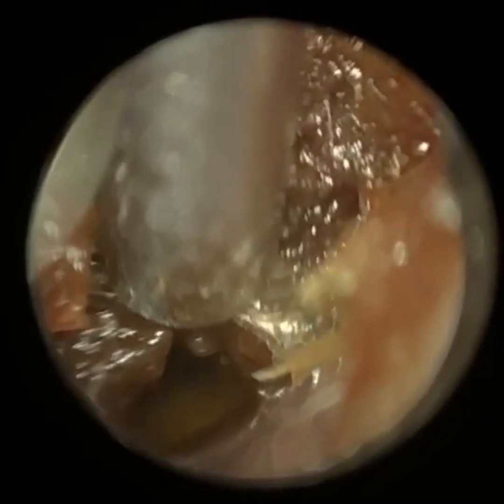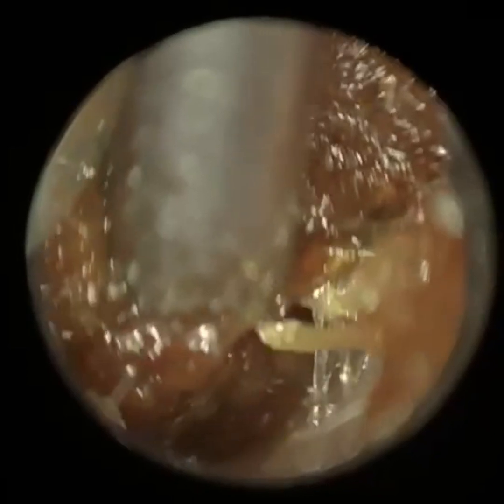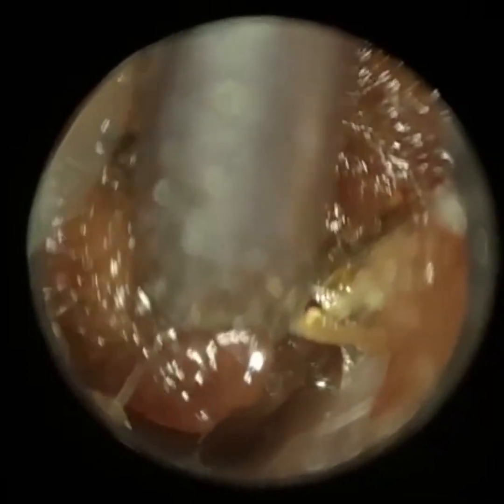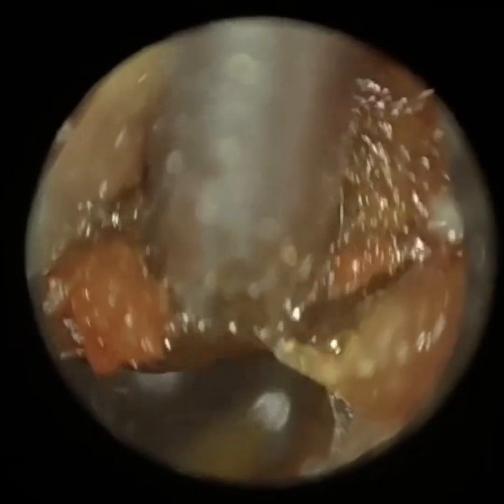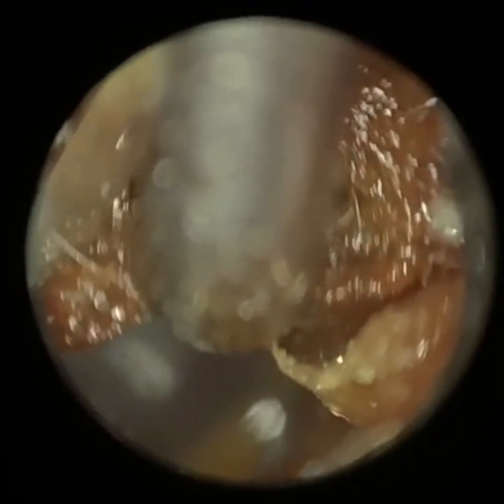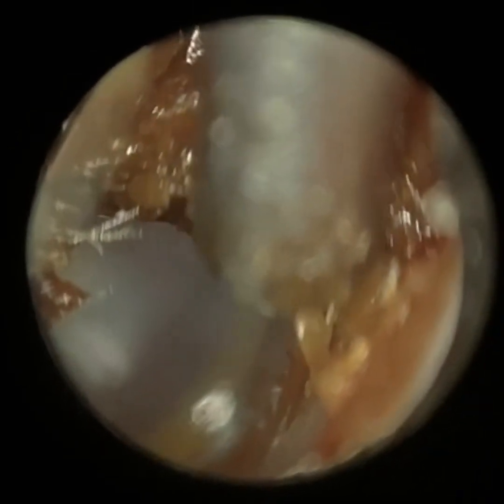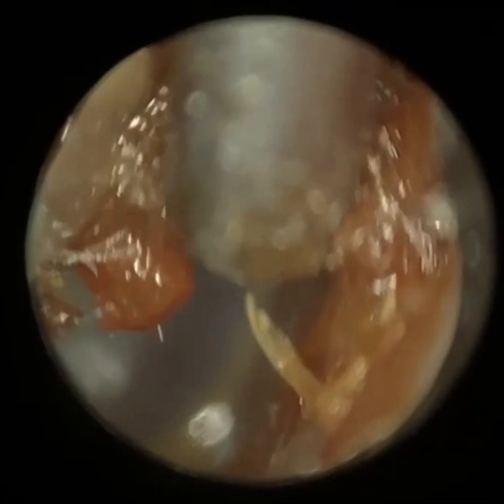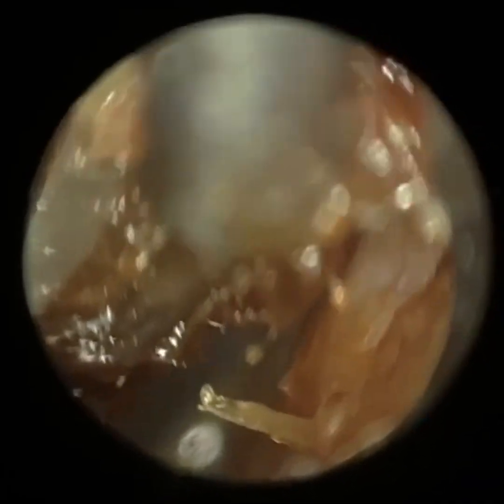Max spoke to me the other day — he was initially trained using headworn loops and he hasn't used them since getting trained with the Waxscope. This is a classic example of a procedure he would really struggle with using head loops because of the limited magnification. Removing wax laterally near the entrance he would be fine, but he didn't have the confidence to go this deep into the ear. He's extremely pleased with the Waxscope.